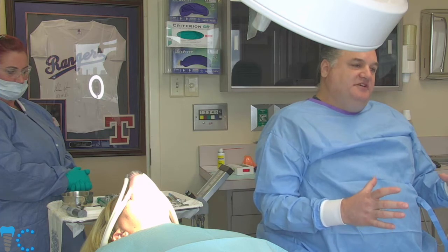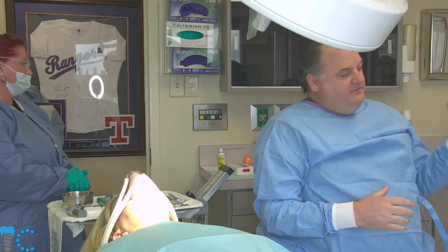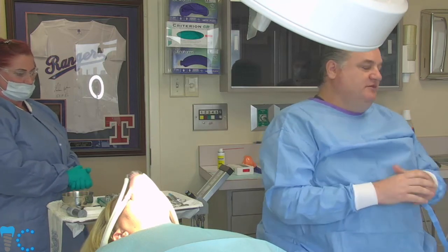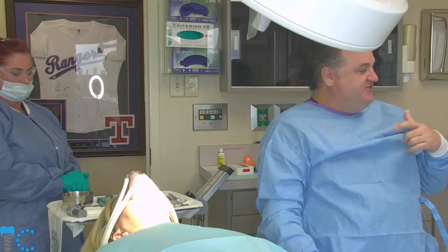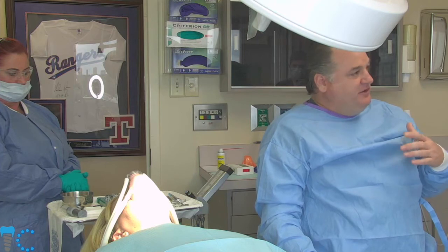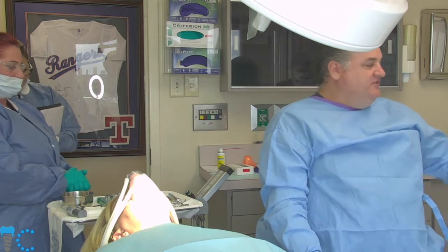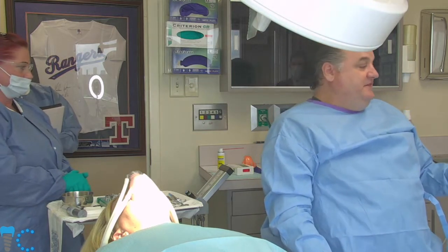So primary stability is helpful in helping that implant overcome an assault by food particles, but other than that, we don't really need high primary stability unless we're going to immediately load this implant. So if we're putting a series of implants in an edentulous patient with cross-arch stabilization and we're trying to do immediate load, then we would want an implant with high primary stability, and we would select an implant that's designed for that. But these implants are not designed for that, and since we're primarily doing single tooth applications, no implant that's designed for that has a low failure rate.